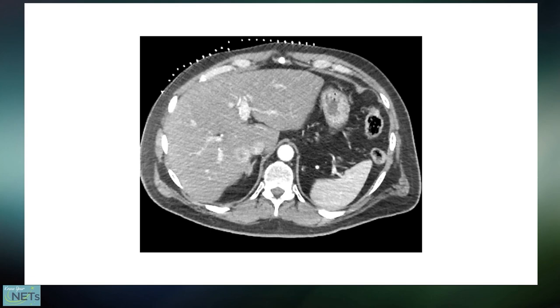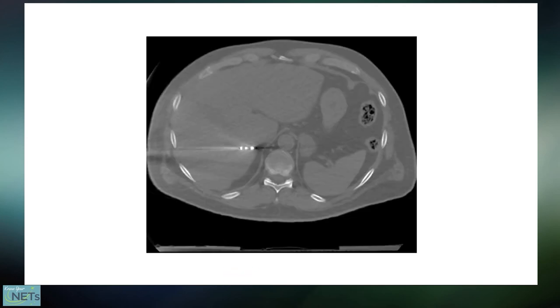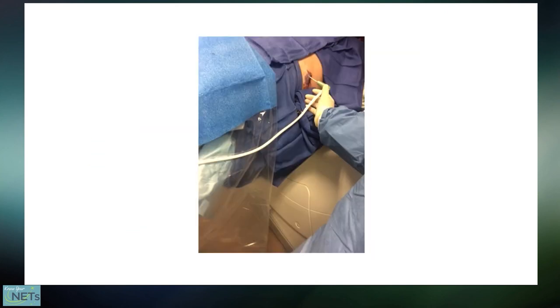So we bring this patient in and we do this under CT guidance. We scan the patient just like we would do a normal CT scan. We identify the tumor right there, and then we guide a needle into it. Again, this is the Cliff Notes version. This is after a few different repositions. But once that needle is in place, it's as simple as plugging it into the machine and burning it for usually anywhere between 5 and 10 minutes. For this one, we probably did 6 or 7 minutes. And there's the needle in the target.